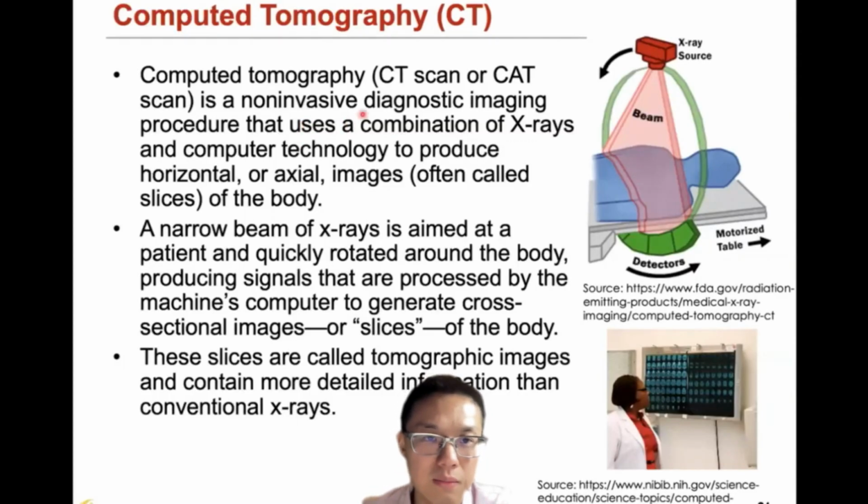So the next modality is computed tomography, CT, or CAT scan. So basically, this is X-ray plus, right? You can consider it has the same imaging mechanism, but you have multiple scans of the body. So this is a 3D volume. X-ray, typically, we're referring to like a 2D image.